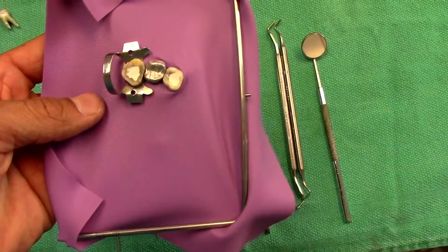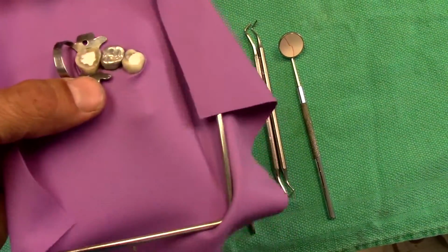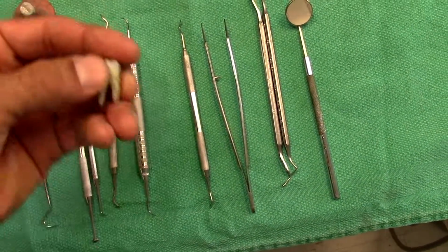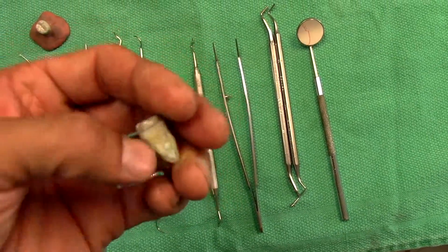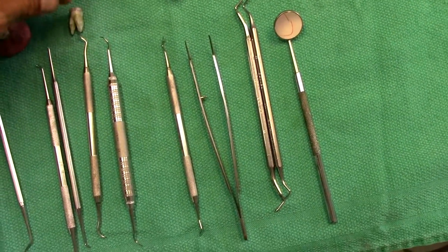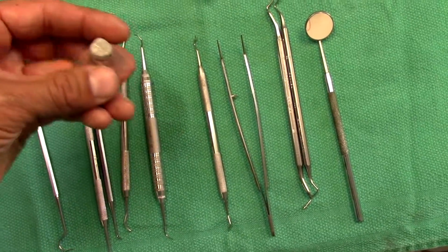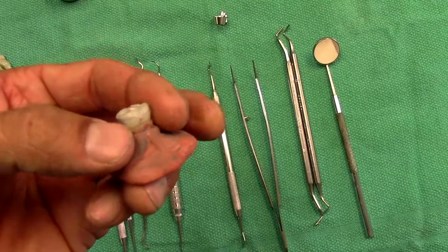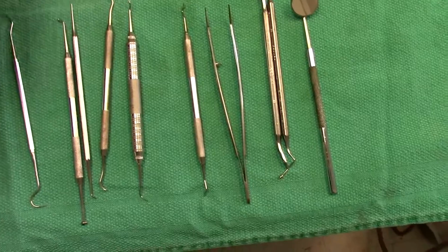What I've done here is we've mounted it and I actually put the teeth into some triad just because they move. If you are just doing a single tooth, I recommend you can do it just like this, but the problem is that the band, our automatrix or even Tofflemire, slides down. Slides apically down the tooth, so it doesn't stay seated. So I recommend putting it in some putty or some sort of acrylic or anything that just gives an apical stop for the band. So you need your extracted tooth.